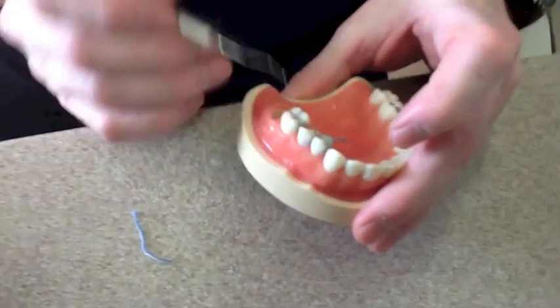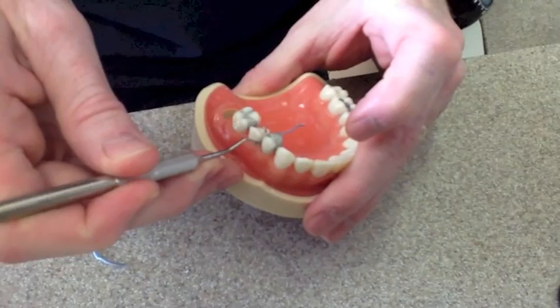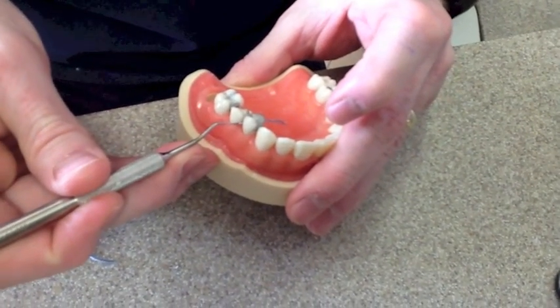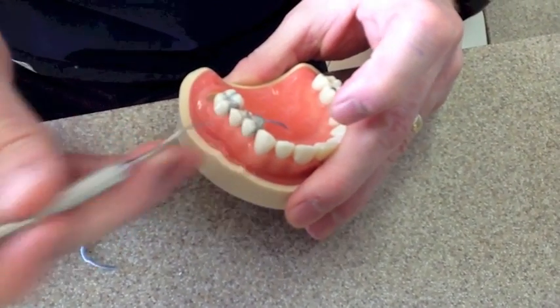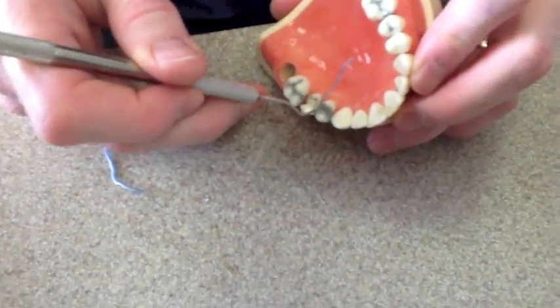Now, see the next bump? I'm going to actually just keep following. I'm going to push that bump in. Okay, and I'm going to hold it so it stays. Push it in and hold it. Okay, now on the top, I'm going to kind of come between the teeth and push it and hold it.